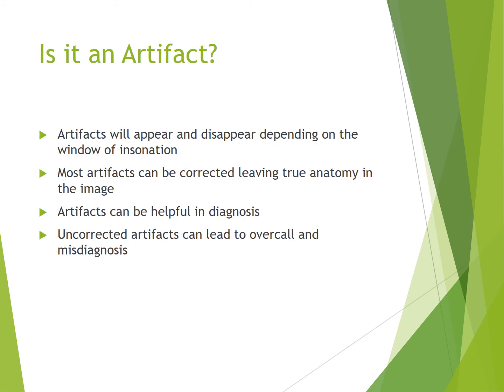So the biggest question that you're going to be coming up with while scanning is deciding, are things actually artifacts? And if it is an artifact, do I leave it or do I try to correct it? Artifacts are going to appear and disappear depending on the window of insonation. If you're using a subcostal window and then move to an intercostal window, that artifact probably should have disappeared or have changed somehow to prove to you that it is an artifact.